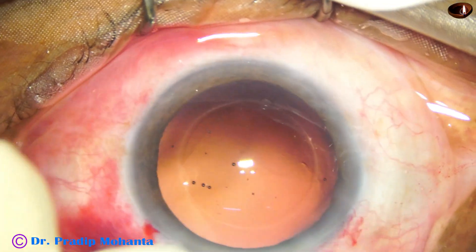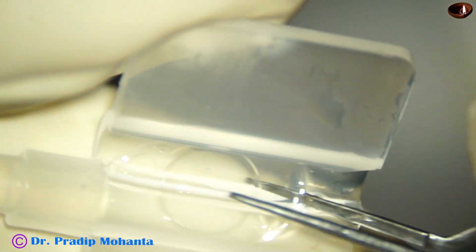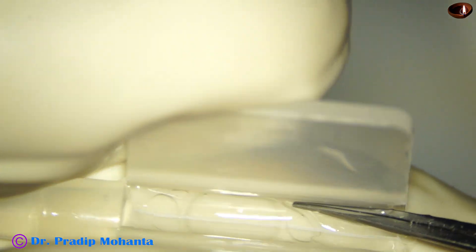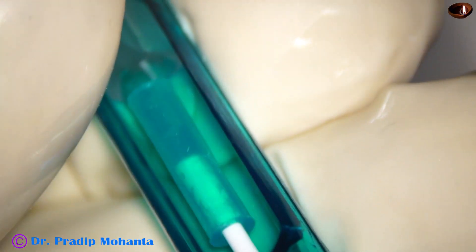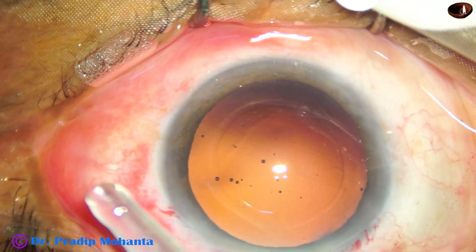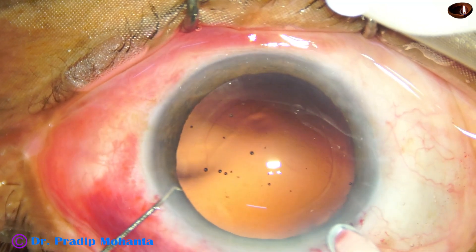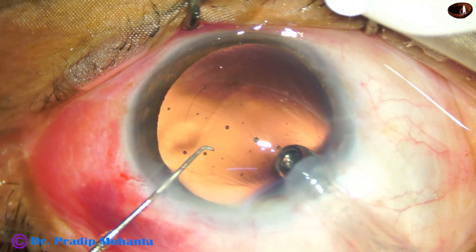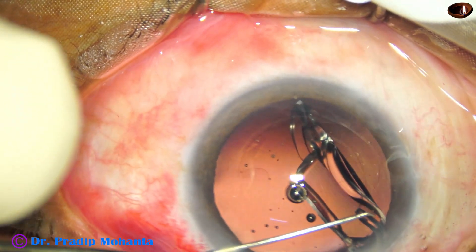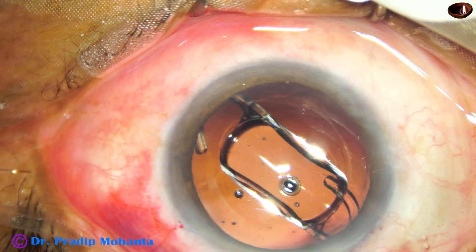The main wound is enlarged because I'm going to use the cartridge, which is wide bore. This is a lens from Bausch and Lomb called Envista, and I'm placing it in a butterfly cartridge. The lens is folded in the cartridge, placed in the injector. The piston moves and now we're going to implant this lens. In my left hand is a Sinsky hook kind of instrument, and in my right hand is the intraocular lens delivery system. The leading haptic goes in the capsular bag and the trailing haptic is pushed by the left hand instrument into the capsular bag.